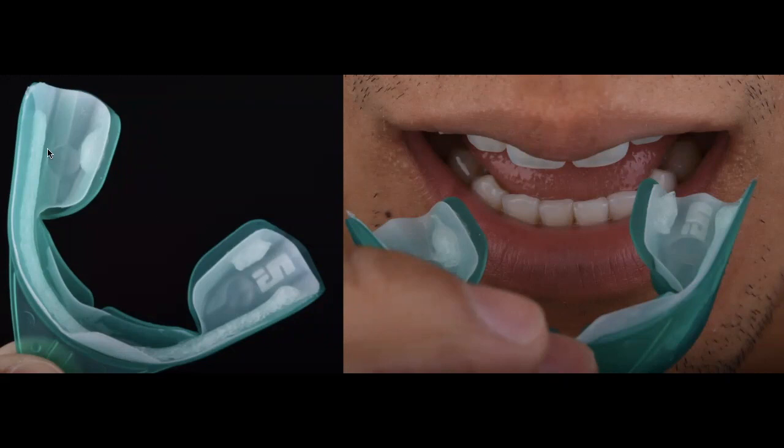Now, the first thing that I want you to see is that the gel goes from molar to molar. It doesn't go only to the premolars. You can see that the bleaching gel is only about 3 millimeters in height and 3 millimeters thick. So you know that you have enough gel to stick to the tooth, and at the same time, you don't have enough height to make this gel contact the tissue. That's one of the things that you want to avoid. That's why when you look at the trays, you'll see that the gel is actually dispensed in the lower incisal third of the teeth, so that you avoid touching the tissue with this gel. This gel is hydrogen peroxide, so it will definitely irritate the tissue.